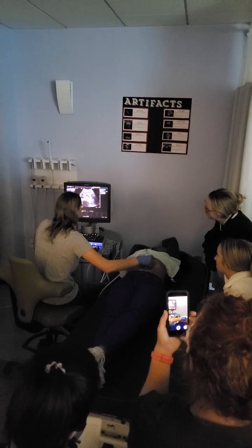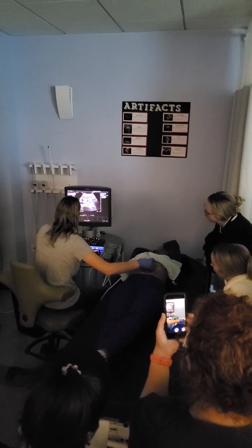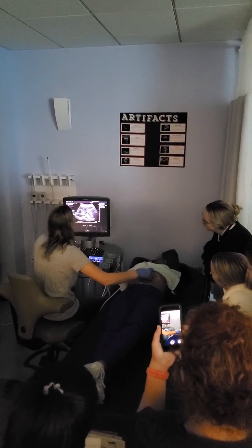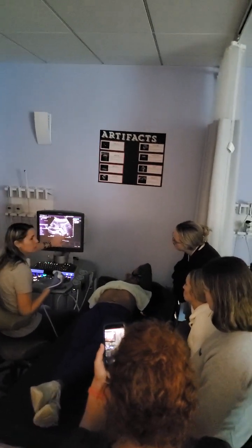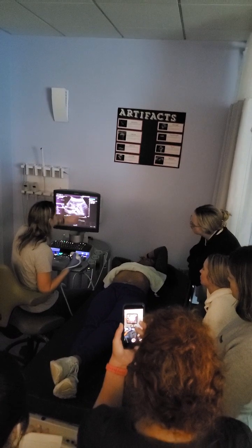And it looks so easy. She's a very easy scan. So we want enough depth that if we're going to see any peripancreatic fluid collections, she's laying on her back, right? So those are going to collect around the tail.